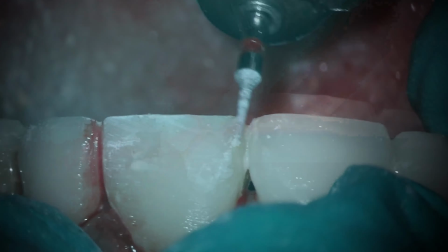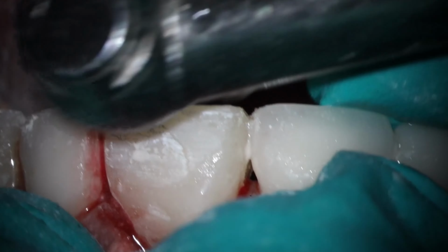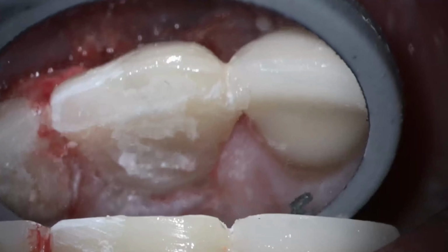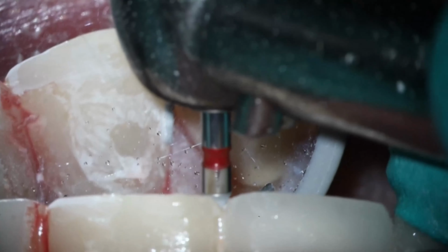One thing I did want to do, though, is take this tooth completely out of the bite. Luxacor is not the strongest material for this sort of thing. It works great under a crown, and I've used it for years. But for being in function like this, just take the tooth out of the bite.